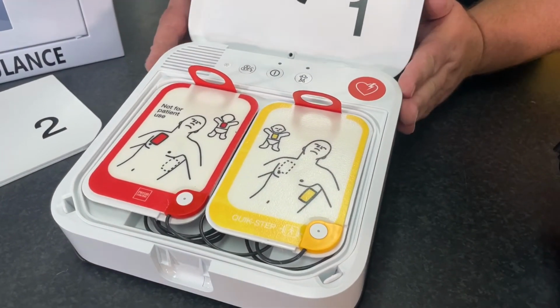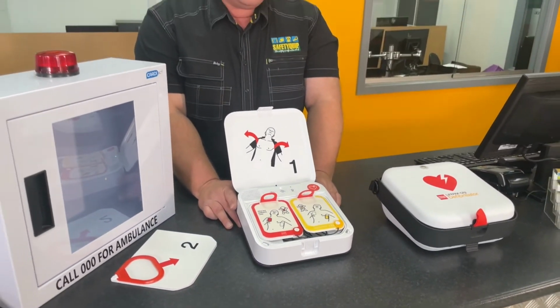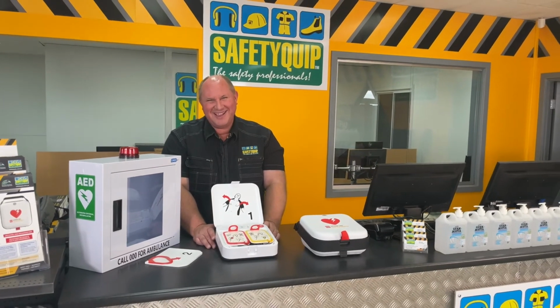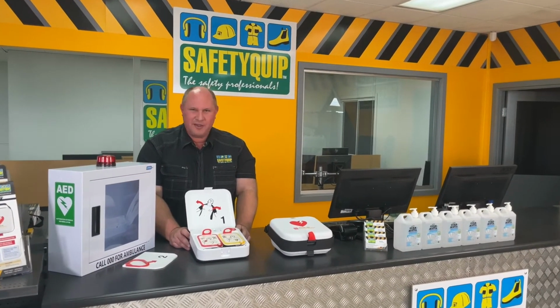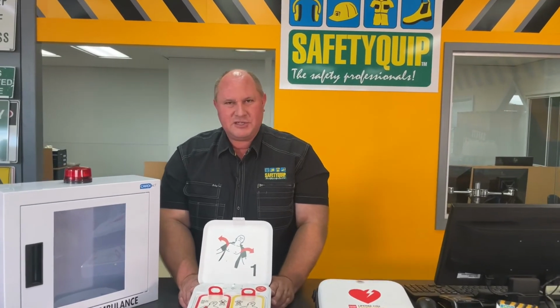Now I mentioned that this one is the Wi-Fi enabled model. That means this unit hooks into your Wi-Fi in your workplace, and you can set it up to alert you when it's unhappy. So if it needs to have the batteries changed, it will alert you to that by way of an email. The unit beeps as well, so there's an audible sound that hopefully passers-by will notice as well.